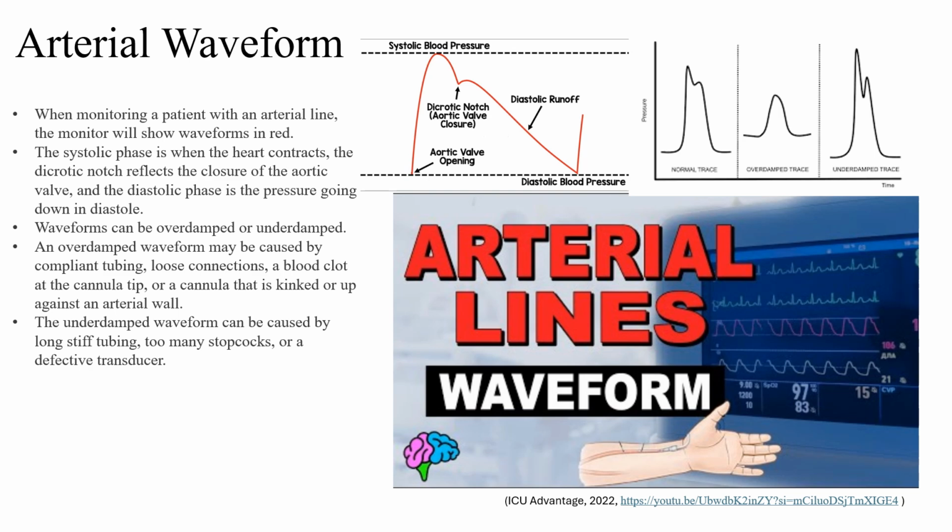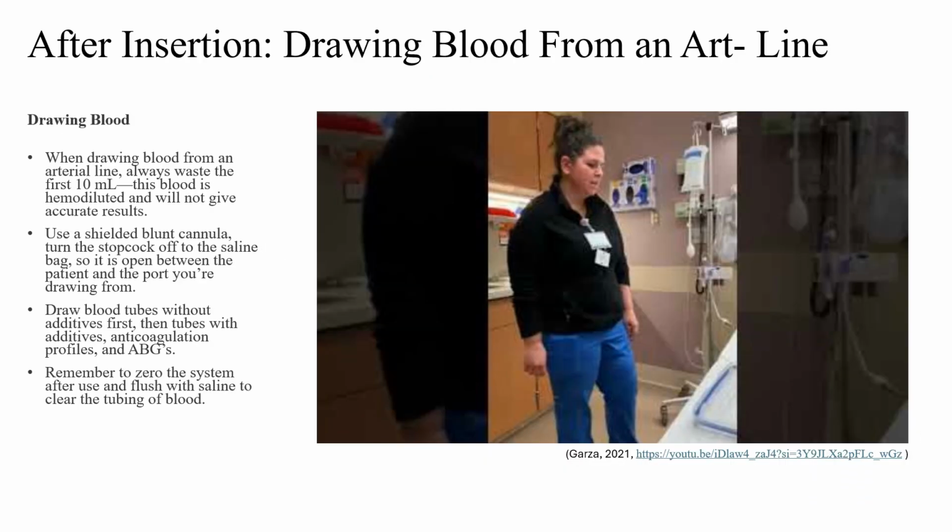All right, if you need to draw some blood from an art line, again, this is a great video. Kim Garza is a nurse and she explains how to do that within your system, and always follow your hospital's policies on how they want you to do it. Some actually have a separate piece to the transducer system and the line where you can draw blood straight out of there. You don't have to interrupt the system at all, which is kind of nice. We do not have that.